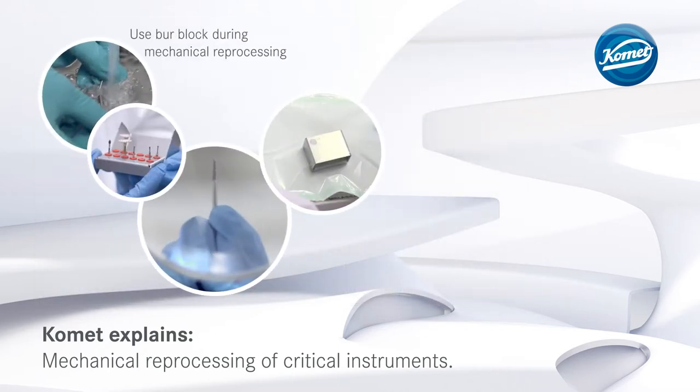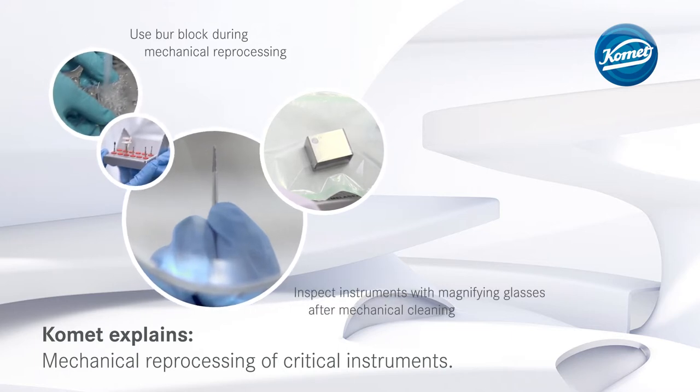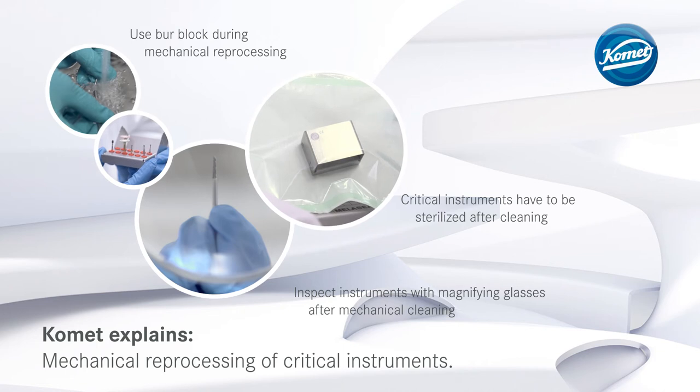The instruments should be placed in a burr block during mechanical reprocessing. After mechanical cleaning, inspect instruments with magnifying glasses. Instruments classed as critical have to be sterilized after cleaning.